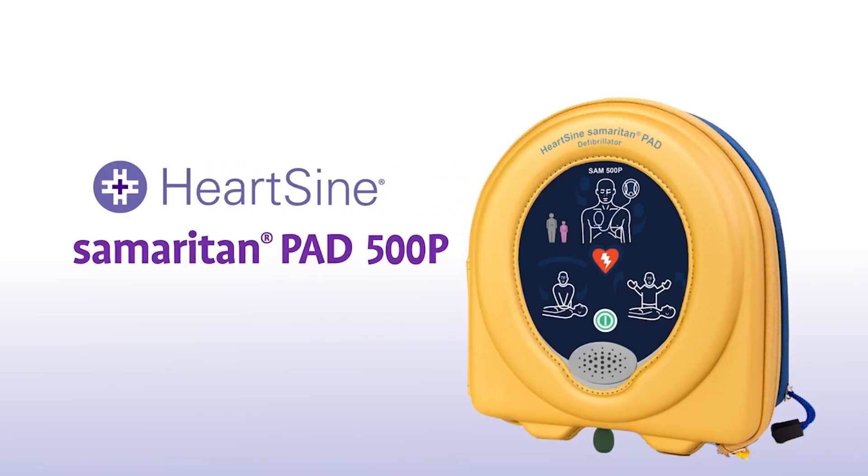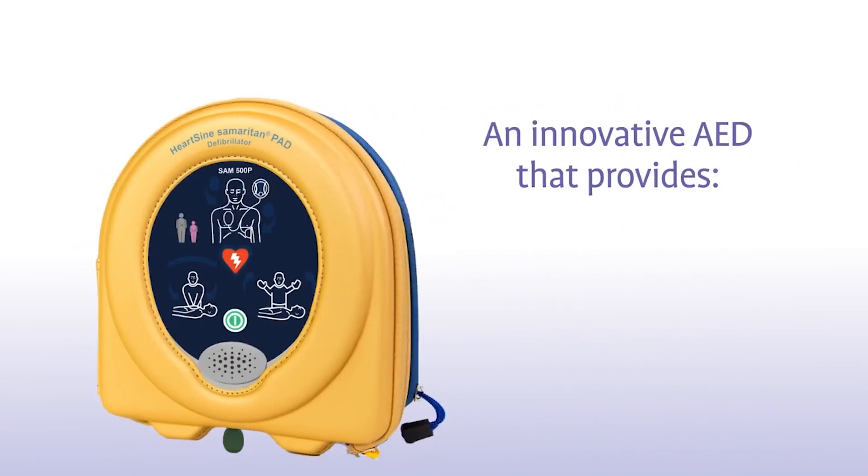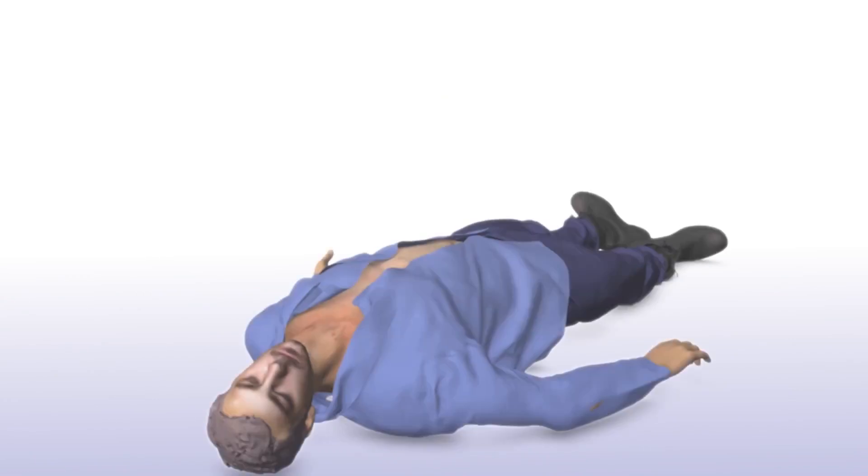You have purchased a HeartSign Samaritan PAD 500P featuring CPR Advisor, an innovative AED that provides real-time feedback on the rate and force of compressions during CPR. Let's look at how to use one in a life-saving situation.